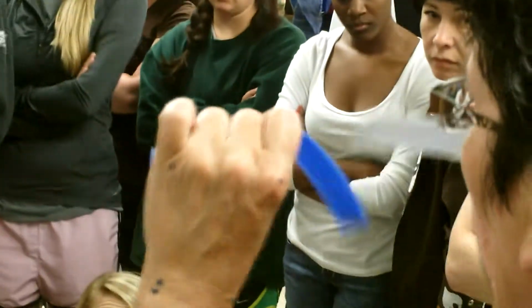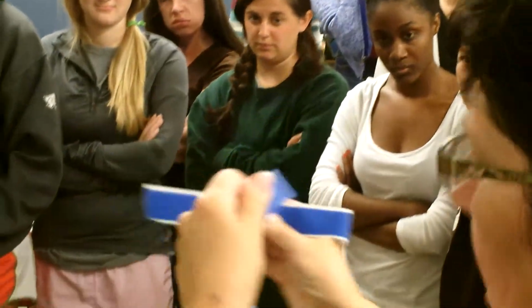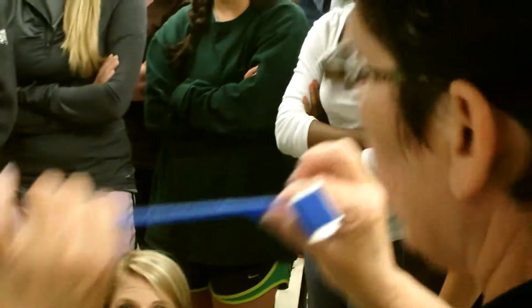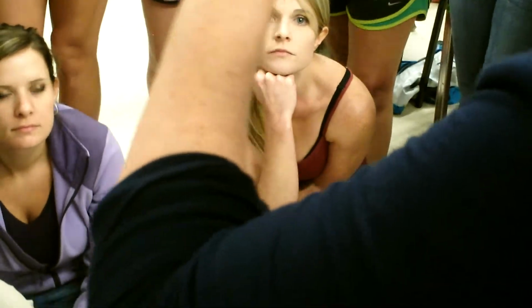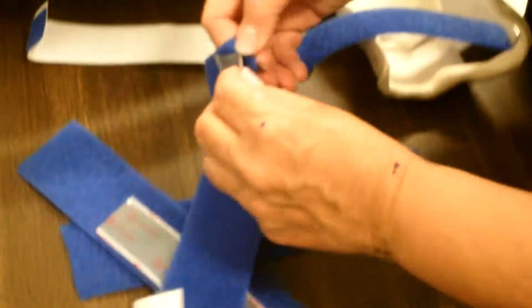Now, this is a crappy job, and I'm sorry, I normally do better than this. Okay, so we have our sticky back. This is called loop. This is called hook. Thanks to the space program for inventing Velcro. So this is going to be the 1-inch strap right here to here, and then a 2-inch here to here, two 2-inch straps. So just a little trick.